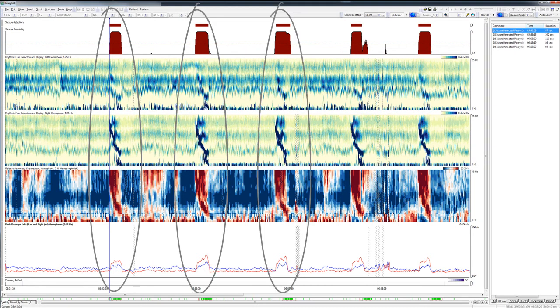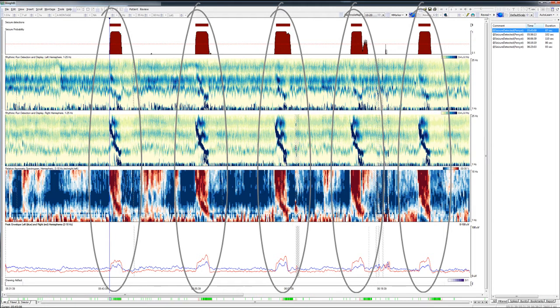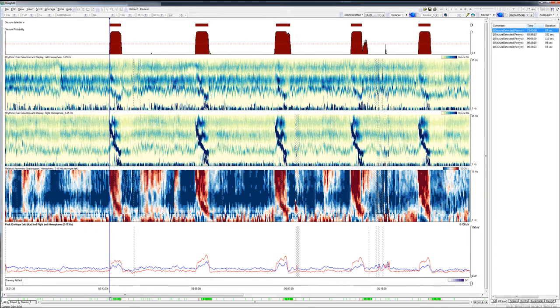This capability allows the monitoring team to efficiently focus attention on events of interest early on in the review. It also serves as a cross-check to help the monitoring team avoid missing events that might escape recognition during rapid visual review of the raw EEG.